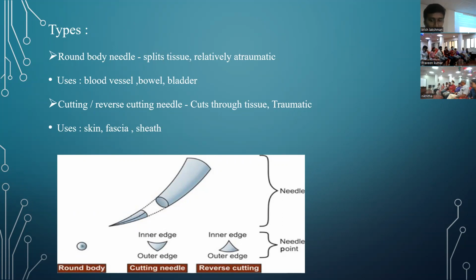I remember I used one in a patient in the UK, and the local consultant said it's easily available, a large, long, blunt needle. You use that to put the sutures in the liver. But yes, liver is a classic example for the blunt.